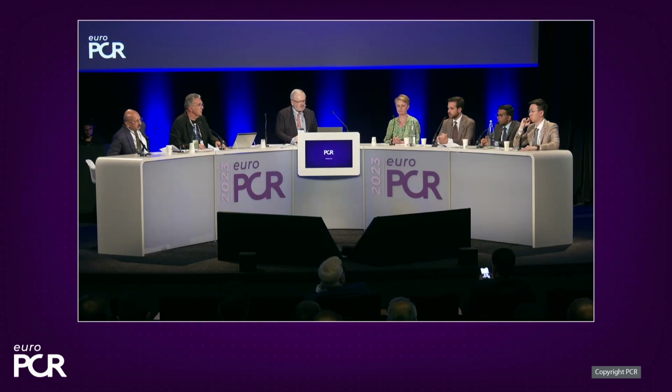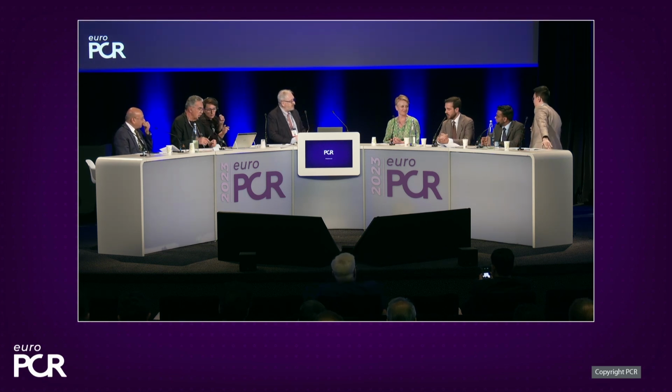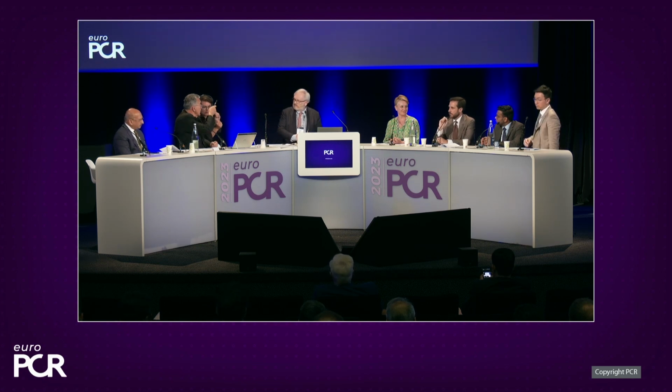The question did disappear, but the question was, are we ready to perform ad hoc PCI or CABG with only multi-slice CT scan evaluation? I think that was for Alessandro, no? Yeah, so although I might admit that probably we're not there yet, I do think that technology improved tremendously during the last years. The quality of the image and the ability to assess the morphology of the plaque really are improved.